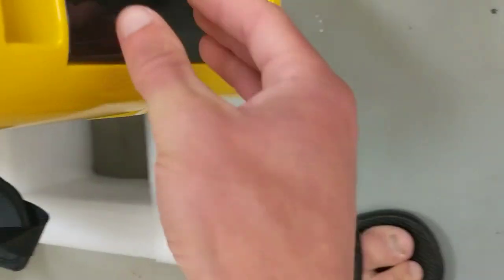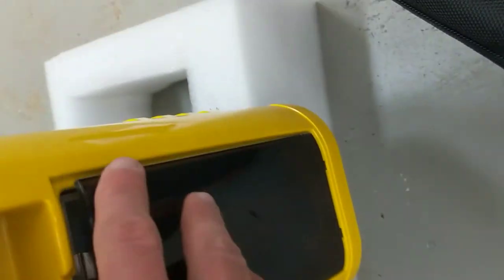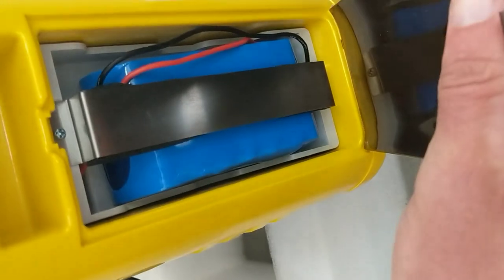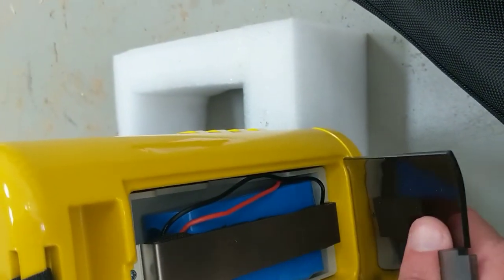What do we got over here? Ah, there's our battery. Cool.